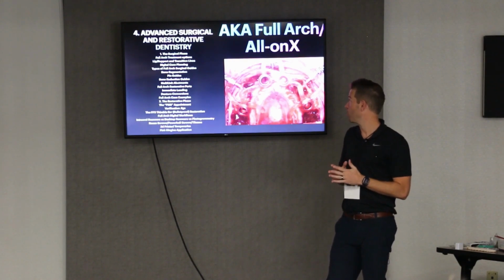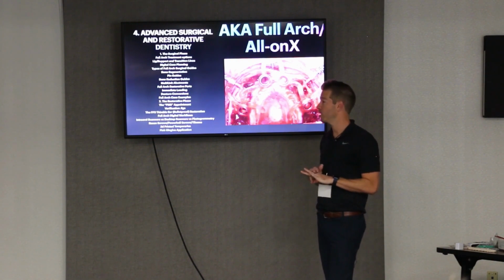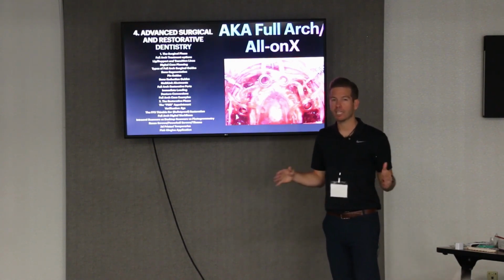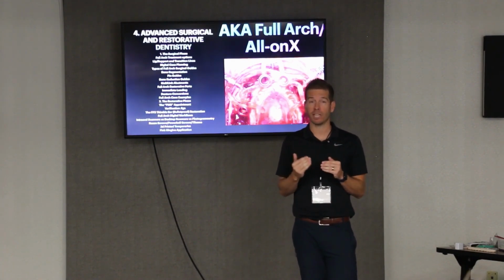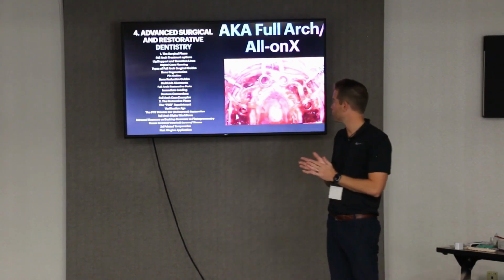We're going to talk about different types of surgical guides. There's really three, and I'm going to really hone in on the one that I think you guys should be looking at for your first cases. Bone segmentation, pin guides, bone reduction guides. Those are some of the more complex aspects of this, and I like to personally do a workflow that attempts to avoid those aspects, and that's what I'm going to teach. How do we keep this simple and predictable, like I was talking about?